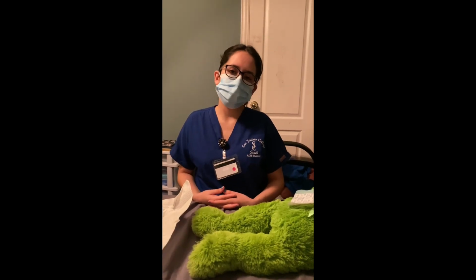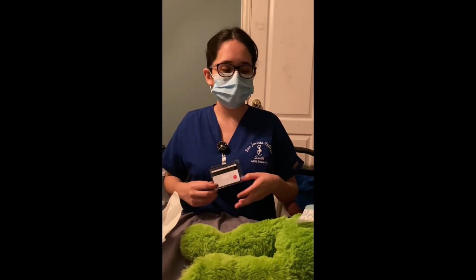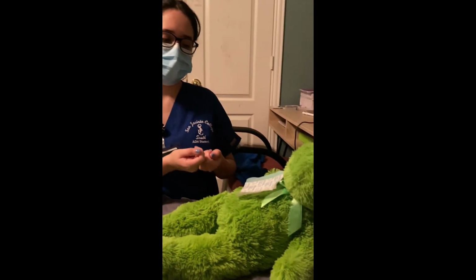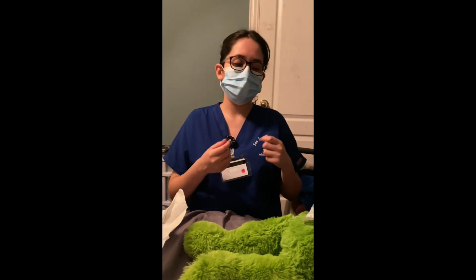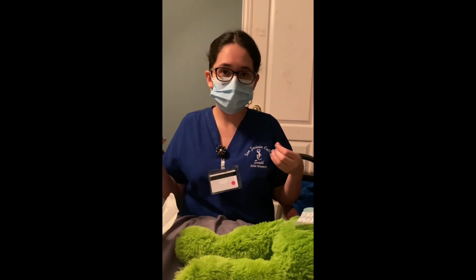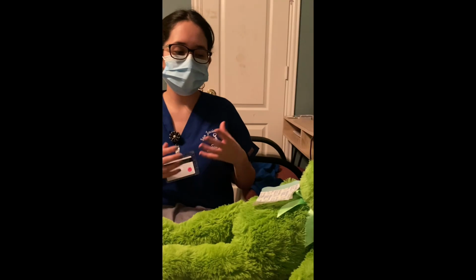So after I cleaned the patient's skin with the ChloraPrep and allowed it to air dry, what I applied to the patient's site was a bio patch. Because I don't have the actual bio patch with me, the blue side would be facing up, and the reason for the bio patch would be to reduce the number of microbes that could potentially get into the patient's insertion site.